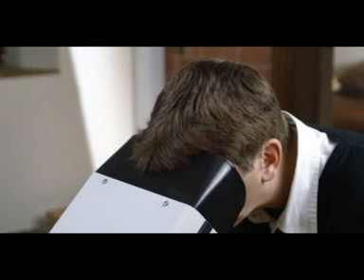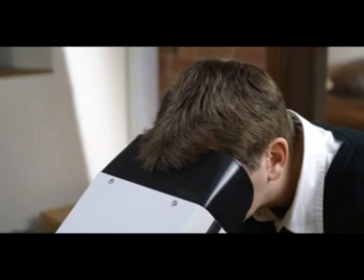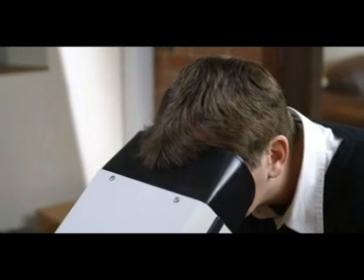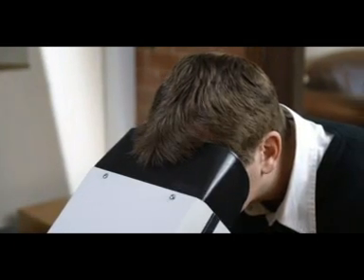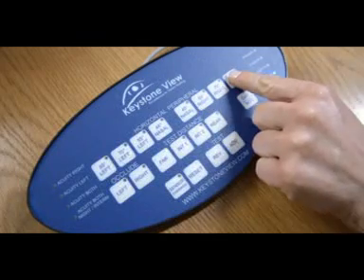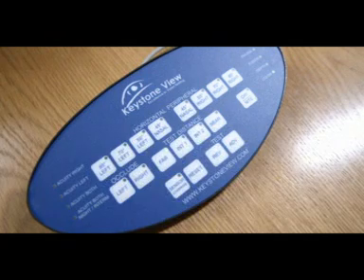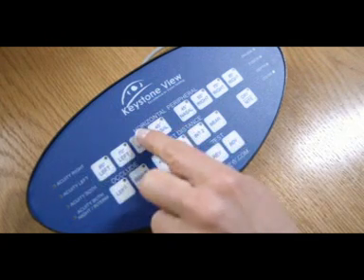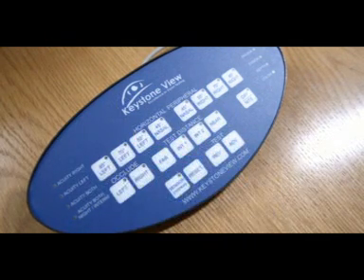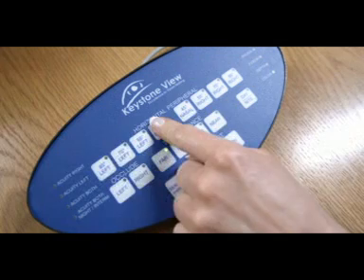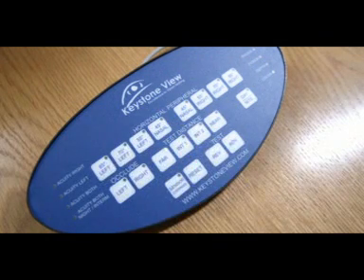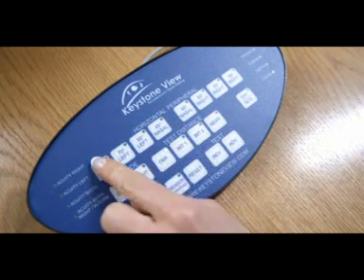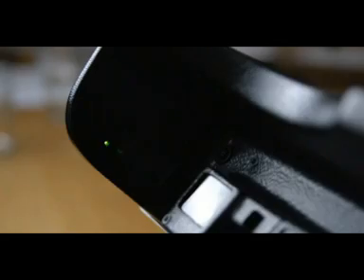At any time, a light may flash on either the right side or the left side, so please can you respond with either left side or right side? Use the control panel to show a 45 degree nasal field, and to check temporal fields at angles of 85 degrees, 70 degrees and 55 degrees. Please note that the 45 degree test for the right eye lights up on the left side and vice versa.